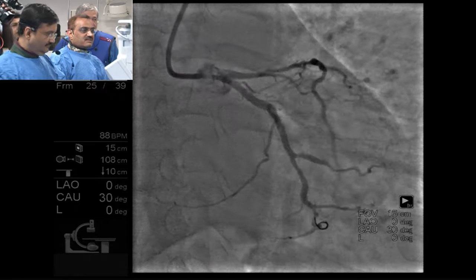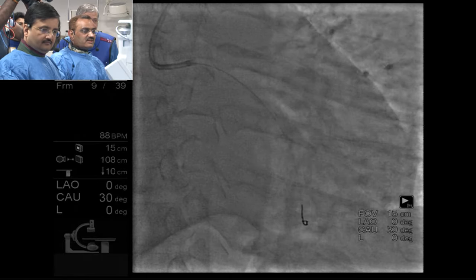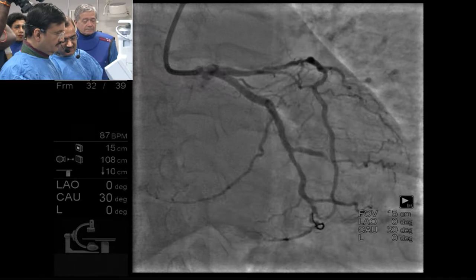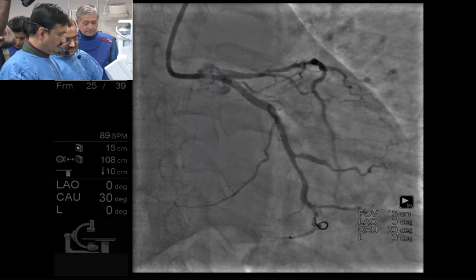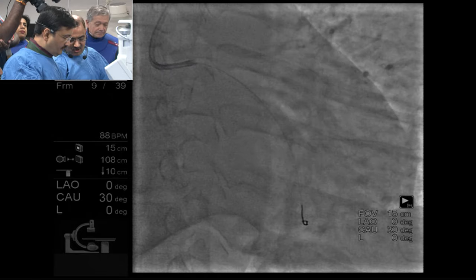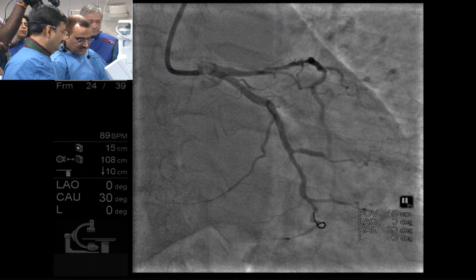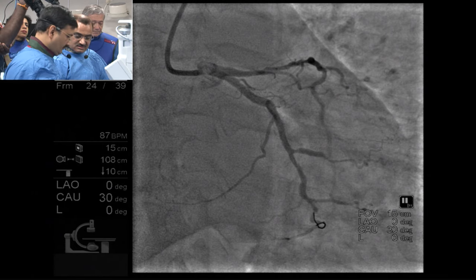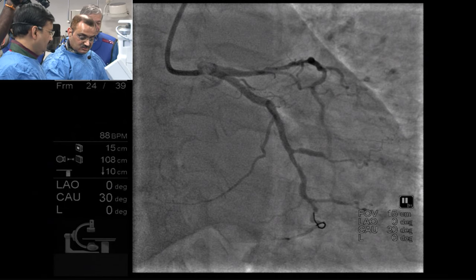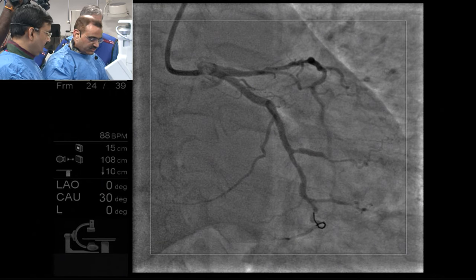So, Tak, to answer your question, I try not to actually go and recross it and monkey around with those stent struts because we don't know how it behaves. That is kind of garden variety angioplasty, right? All they say in the study is that if you have a normal origin of the side branch, you generally do not do anything and just stent across it to save that branch. I respect your decision.